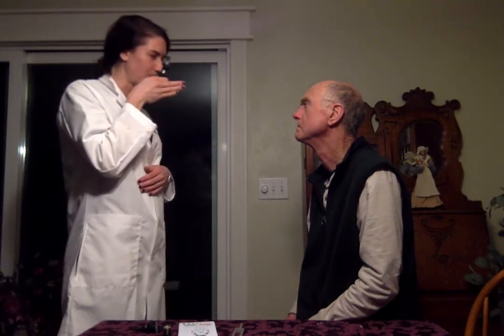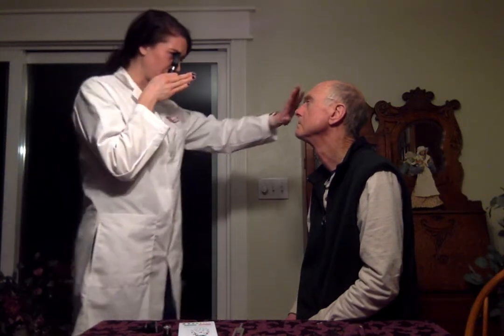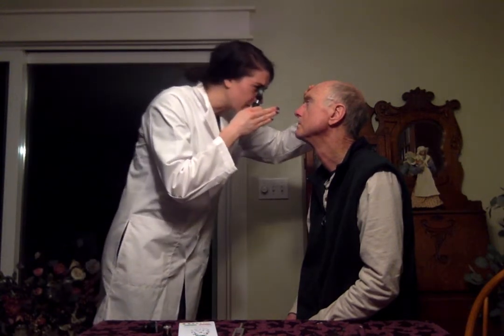And then with my right hand, making sure it's at 0, I'm going to follow and making sure that I'm holding the ophthalmoscope in the right position so that I don't jab it into him. So safely. So I'm going to look into this and look for the red reflex. And then I'm going to place my hand above his eyebrow and start to move forward towards that red reflex.